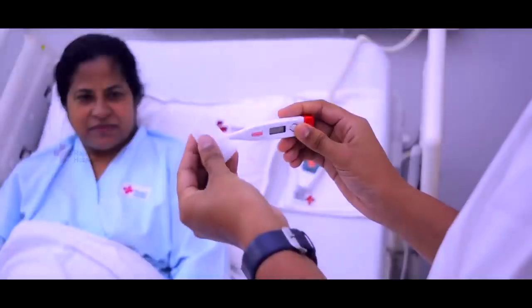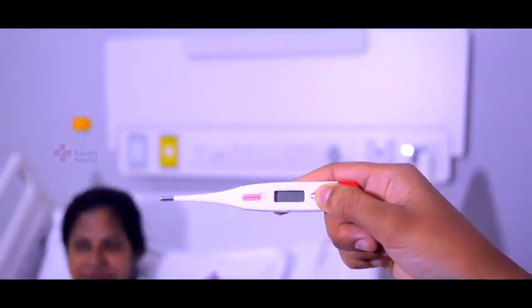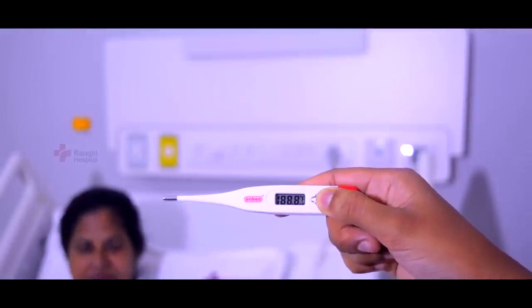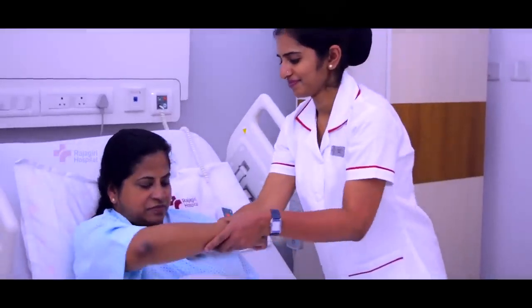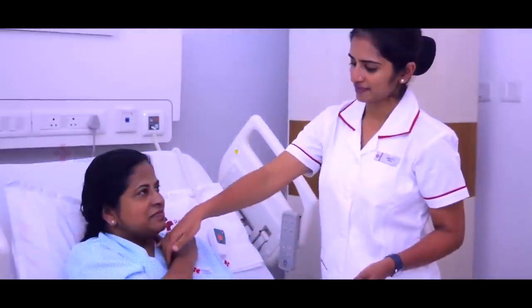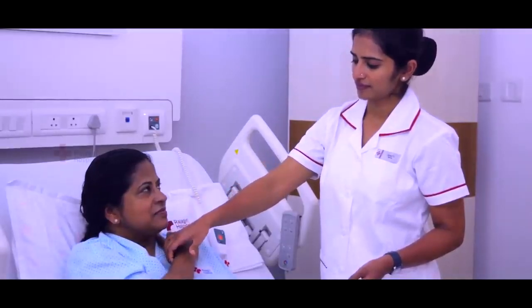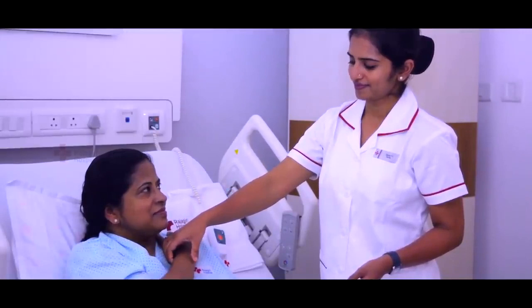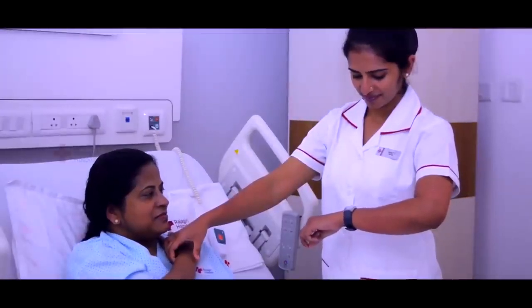Wipe the thermometer with alcohol swab from bulb to stem. Switch it on and wait till a low reading appears. Place the thermometer in the armpit with the hand crossed towards the opposite shoulder. Palpate and count the pulse by placing 3 fingers slightly over the radial artery. Count for 1 minute: rate, rhythm and volume.